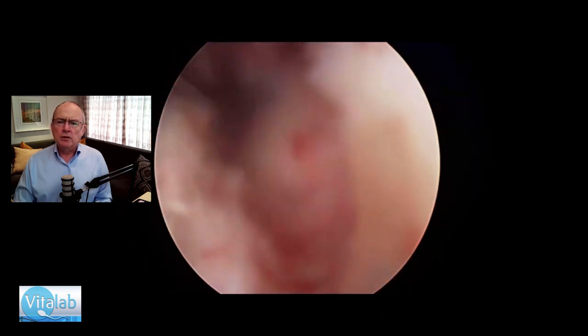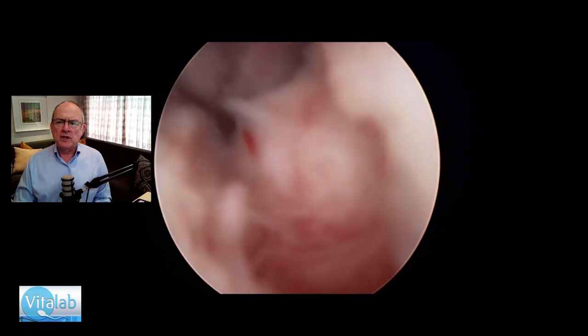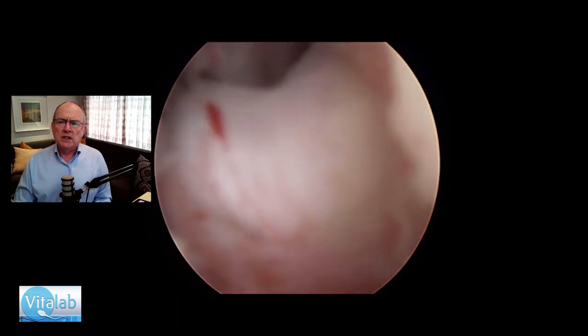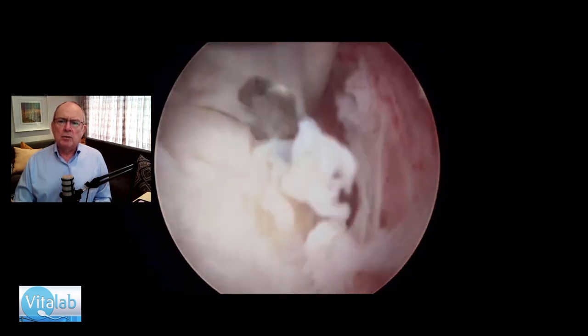I'll be using that endometrium afterwards as the bandage. As you saw, I used my scissors as well as a retractor to get the capsule off the fibroid, and here you see the Medtronic TruClear Ultra gobbling up the fibroid.